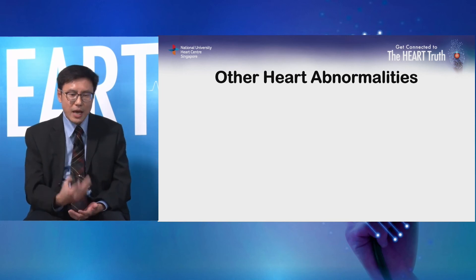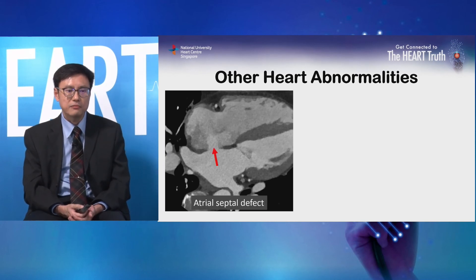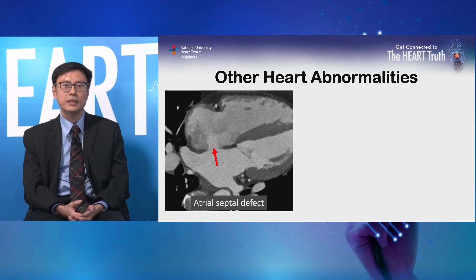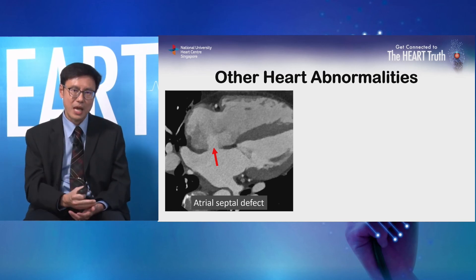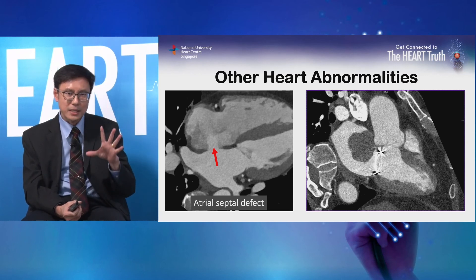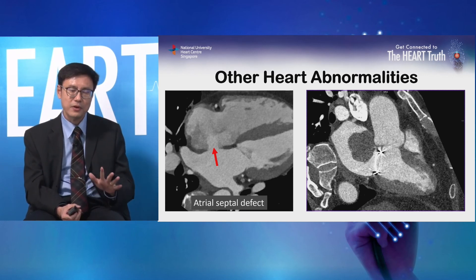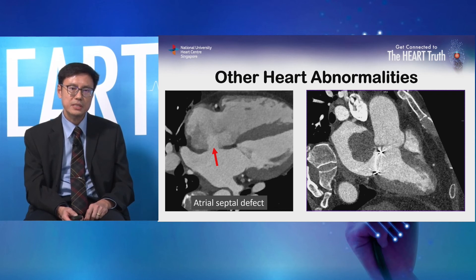Besides the coronary arteries, CT can tell us about other heart abnormalities. This patient has a very large hole in the heart — you can see contrast and blood flowing from the left heart chamber into the right heart chamber, which is not supposed to happen. Another example is a patient with a metallic valve — you can see the bright starburst pattern — and a black object in the heart chamber, which is a blood clot. This is very dangerous because the blood clot can block the heart valve, causing sudden cardiac death.